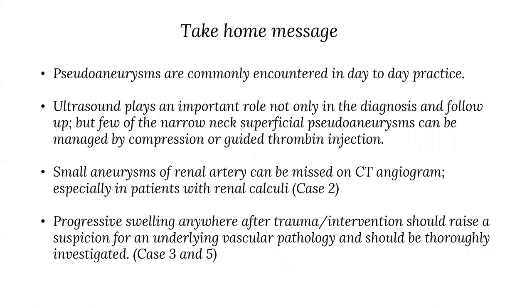So here we could see, pseudoaneurysms are commonly encountered in day-to-day practice. Ultrasound plays an important role not only in the diagnosis, but also in the management of superficial small narrow-neck pseudoaneurysms, which are managed by compression or USG-guided thrombin injection. Small pseudoaneurysms arising from the renal artery can be missed on CT angiography, especially in patients with multiple renal calculi, as we could see in case 2. Progressive swelling anywhere after trauma or intervention should raise a suspicion for an underlying vascular pathology and should be thoroughly investigated, as we could see in cases 3 and 5.